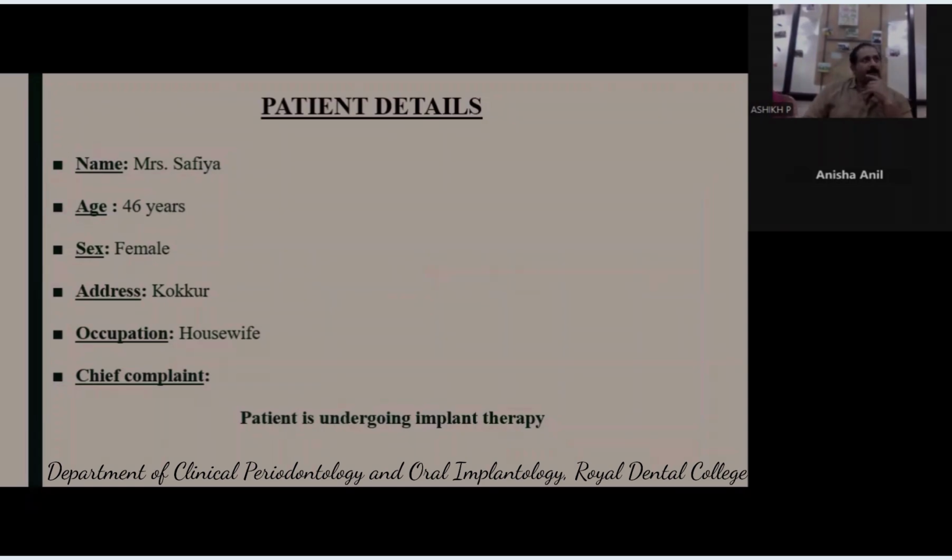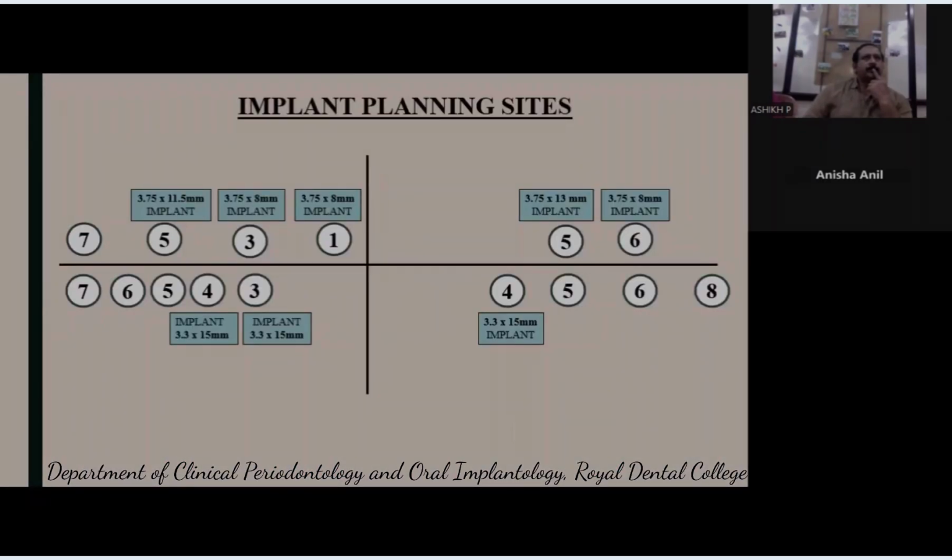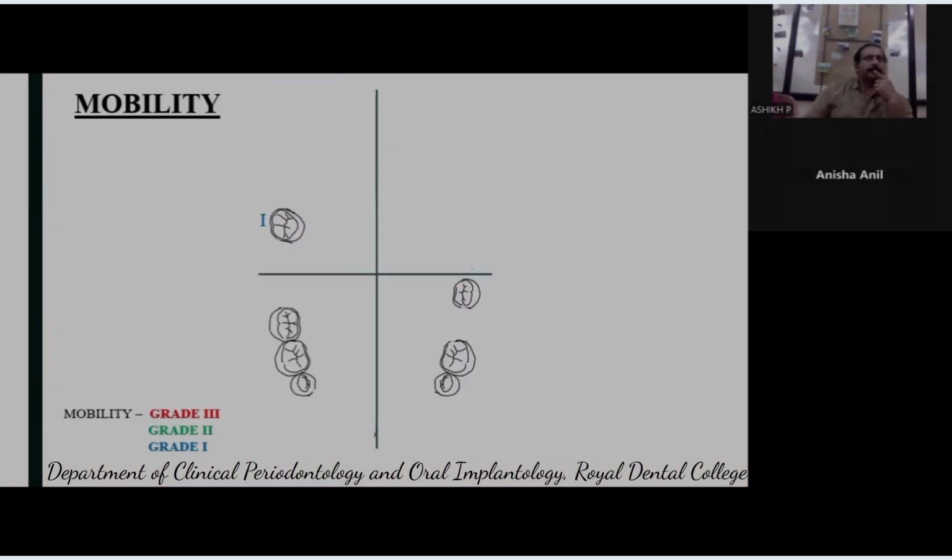Patient is already undergoing implant therapy. So how many have they done already? Once again, lower is completed. Lower is completed. Can I see the panoramic view radiograph?